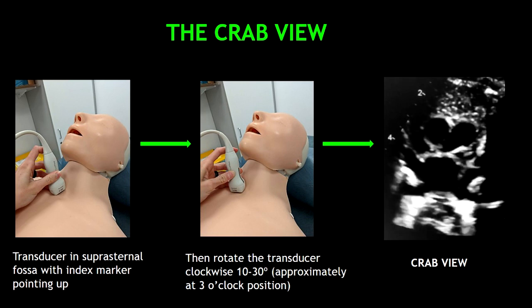It's very simple. First place the transducer in the suprasternal fossa with the index marker pointing up. Then rotate the transducer clockwise approximately 10 to 30 degrees at the 3 o'clock position. With these two simple steps you're going to be able to get the CRAB view.